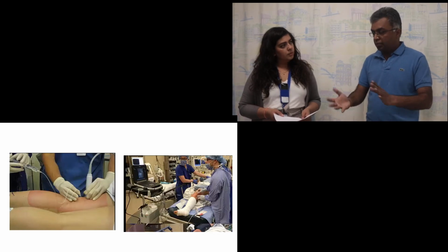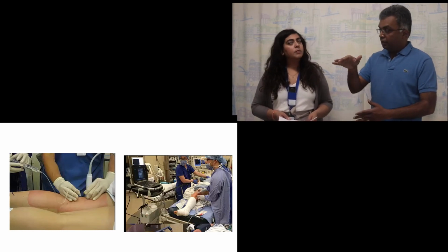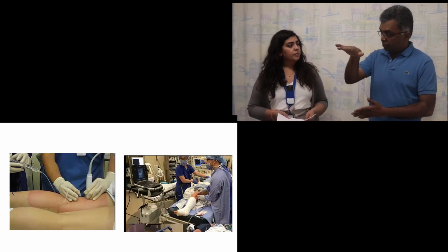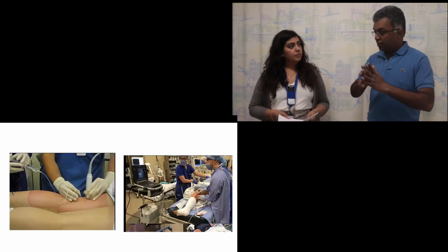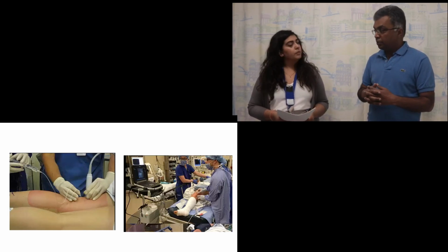It's possible to lie them on the side as well for patients who can turn on the side. You put the leg that you're going to block on the top, because the nerves are mostly on the lateral side. So the leg that needs to be blocked has to be on the top. Then you again do the same approach. The scanning is exactly the same, irrespective of which position you place. And we will see that in the live demonstration.